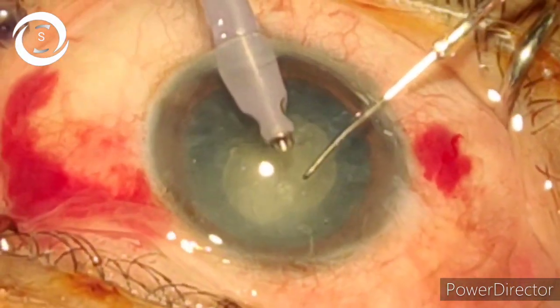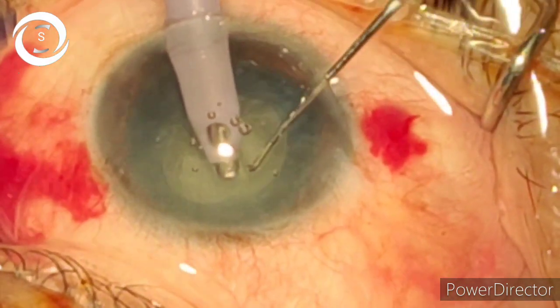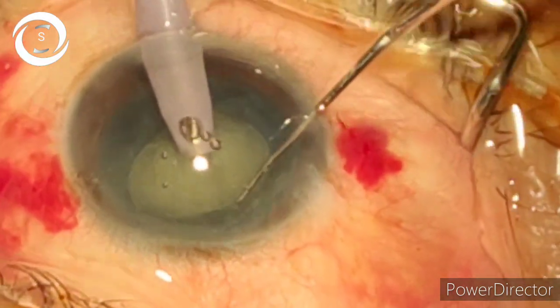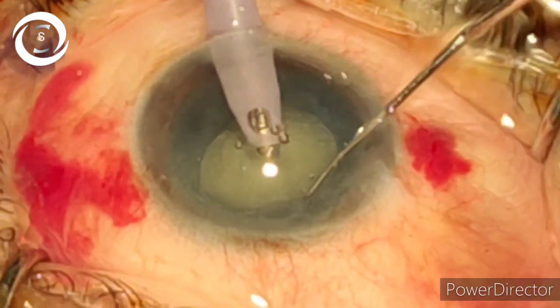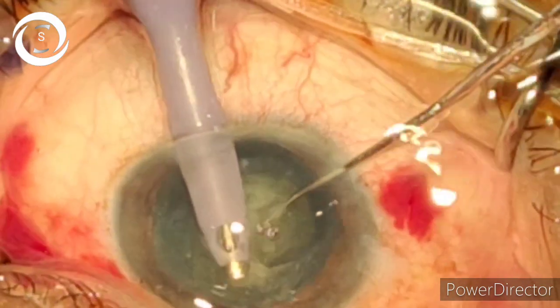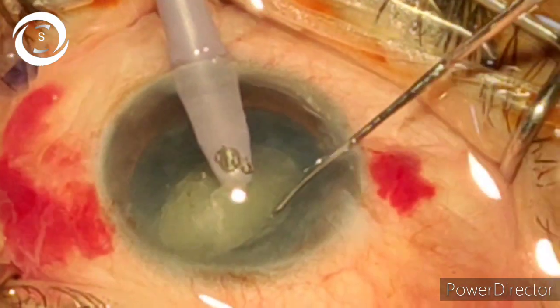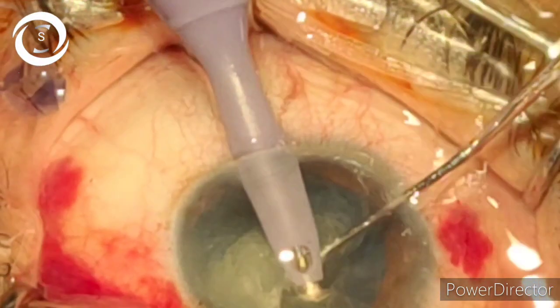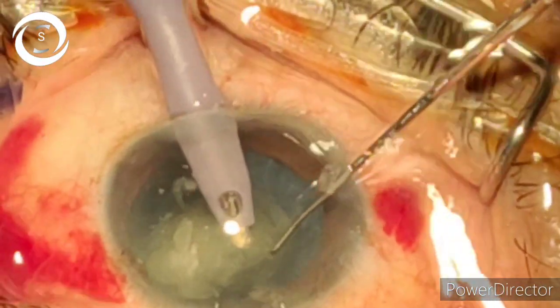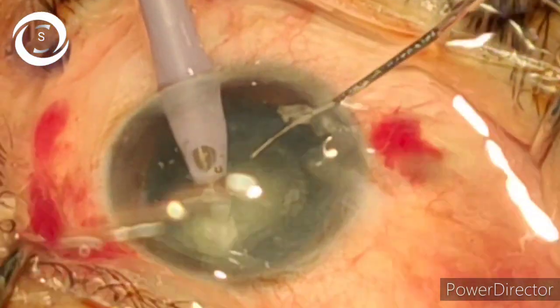Now slowly and gently try to engage the phaco tip at 6 o'clock inferiorly into the nucleus, bury it slightly, and then elevate the inferior edge of the nucleus. Now there is a large space between the nucleus and the posterior capsule. So safely place the second instrument — dialer or chopper — behind the nucleus and chop the inferior nucleus piece slowly. You are very safe and far away from the posterior capsule, avoiding rents.